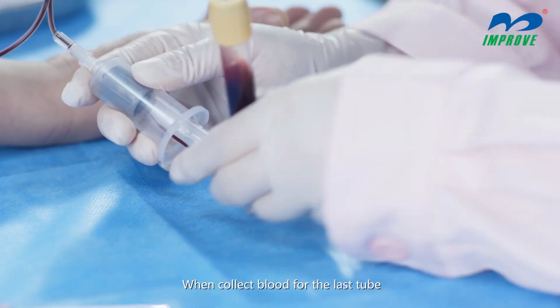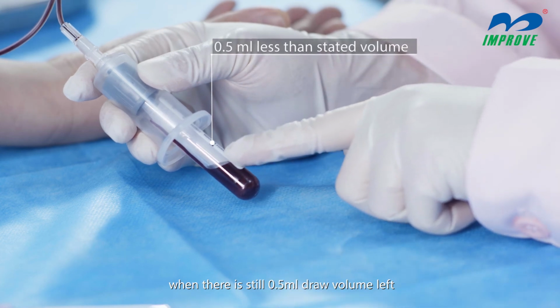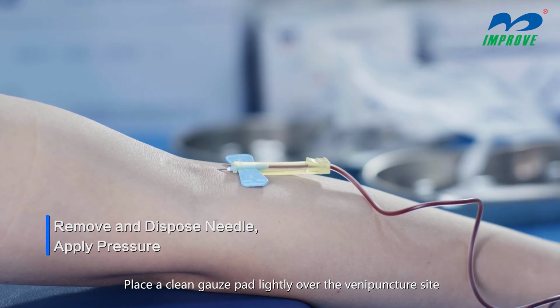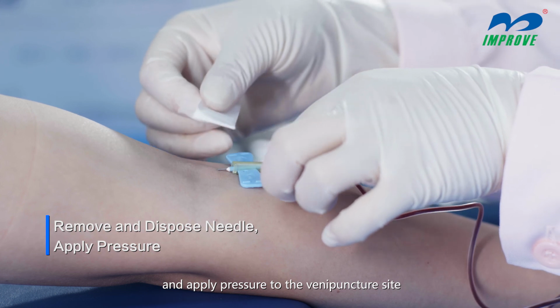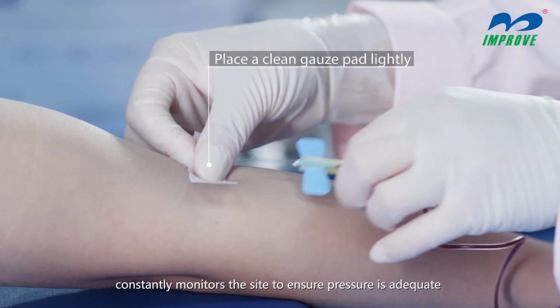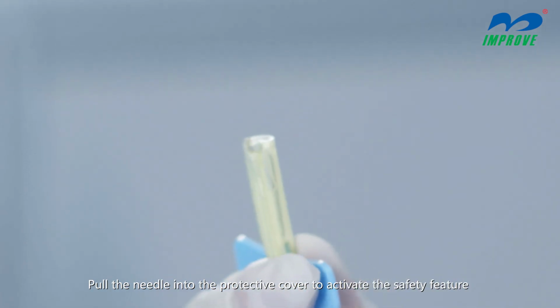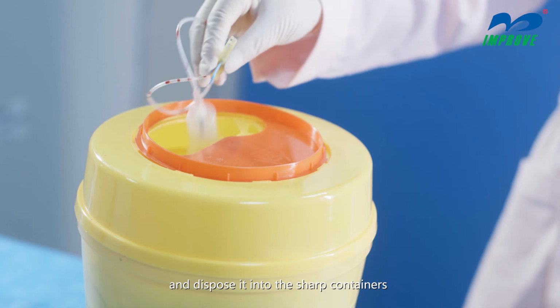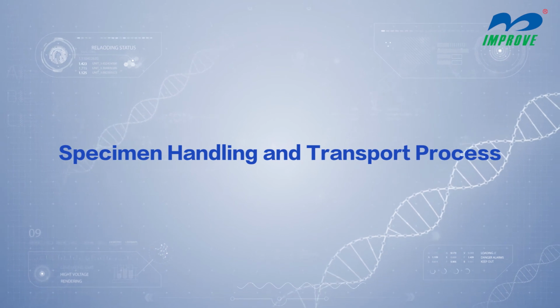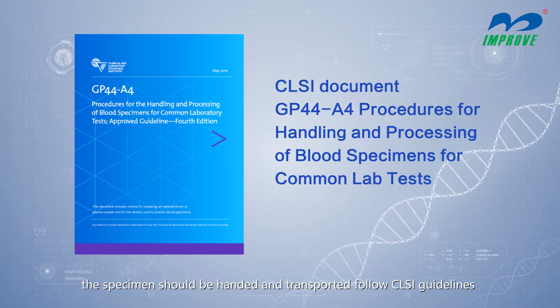When collecting blood for the last tube, remove the venipuncture needle from the vein when there is still 0.5 ml draw volume left. Place a clean gauze pad lightly over the venipuncture site and apply pressure. Patients must apply direct pressure as long as the phlebotomist constantly monitors the site to ensure pressure is adequate. Pull the needle into the protective cover to activate the safety feature and dispose of it into the sharps container. After blood collection, the specimen should be handled and transported following CLSI guidelines.